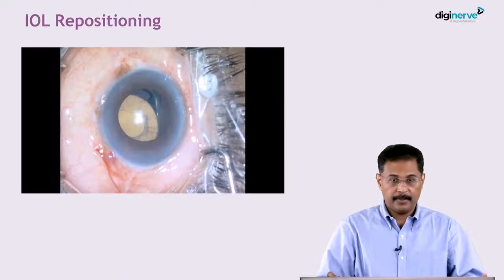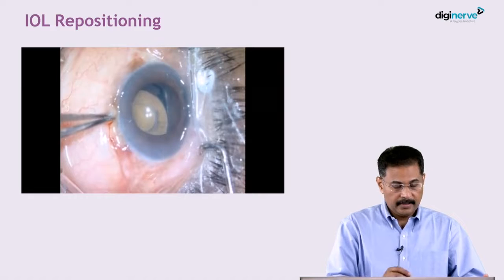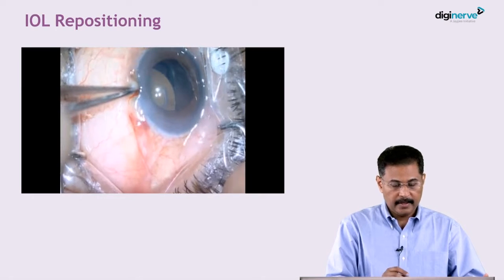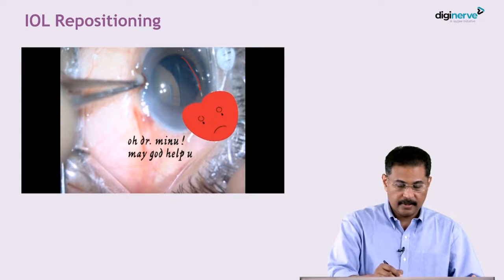One case of IOL repositioning. This is a single-piece foldable IOL inside the bag — the whole bag and lens complex has descended. You can see a capsule tension ring also in the bag here.